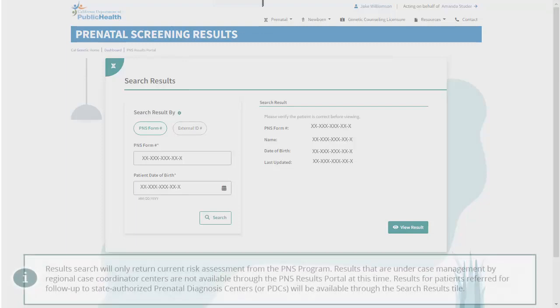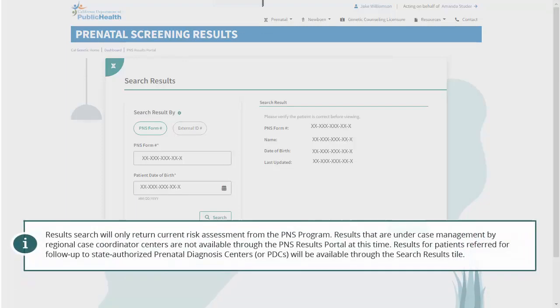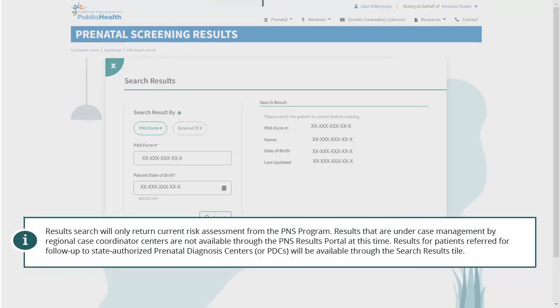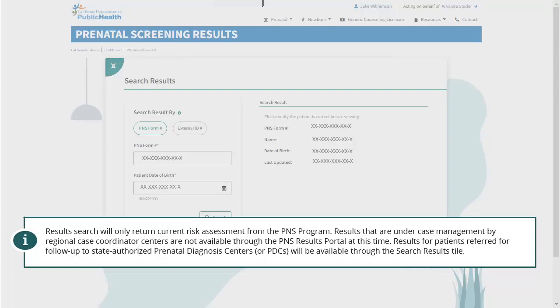Results search will only return current risk assessment from the PNS program. Results that are under case management by regional case coordinator centers are not available through the PNS results portal at this time. Results for patients referred for follow-up to state authorized prenatal diagnosis centers will be available through the search results tile.